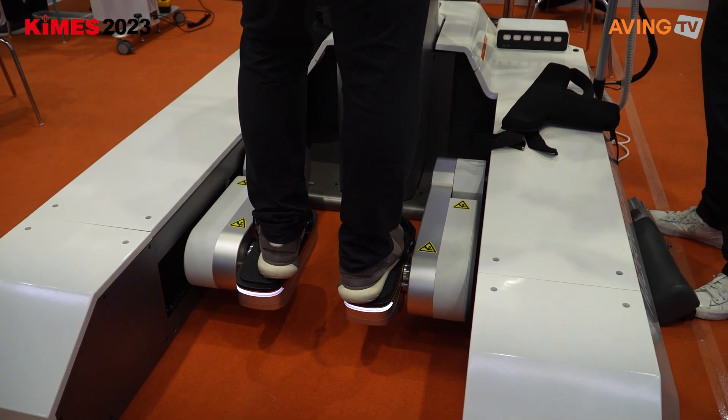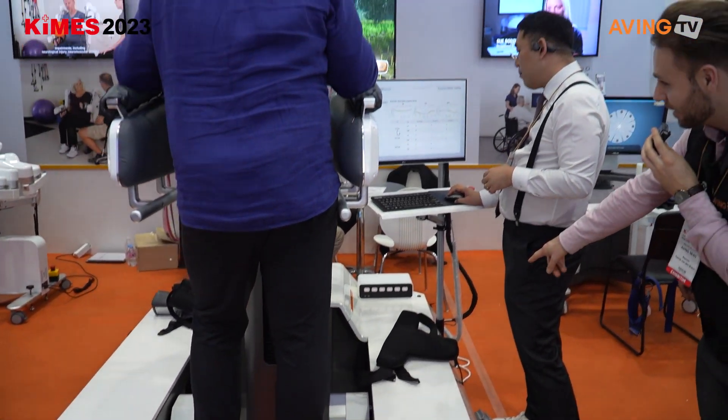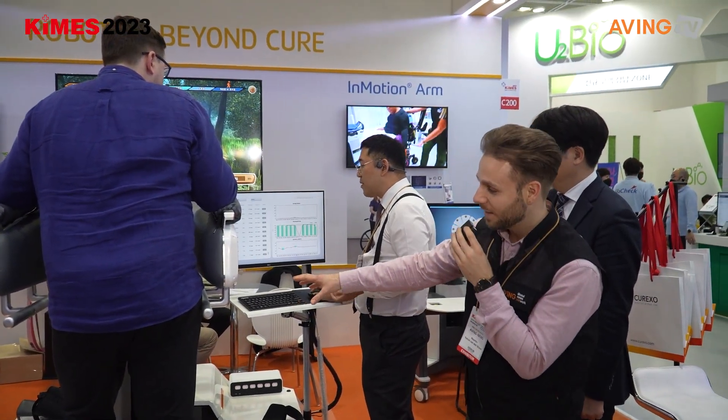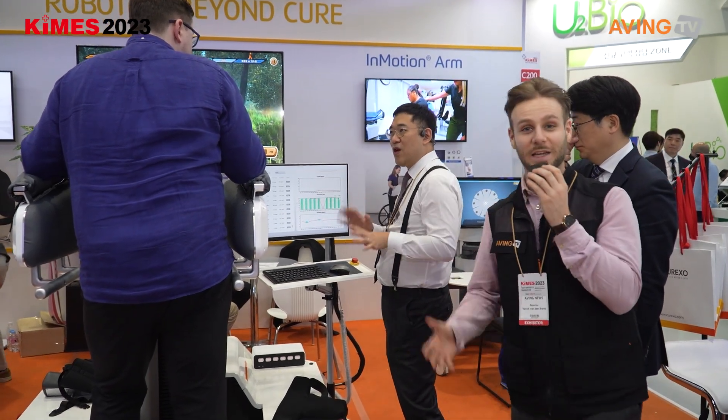Normally you can attach a small harness as well, so it's extra safe for the patient. I think this is the harness here. If the patient is in this machine and the harness is on, they cannot fall from the machine, so it's extra safe.